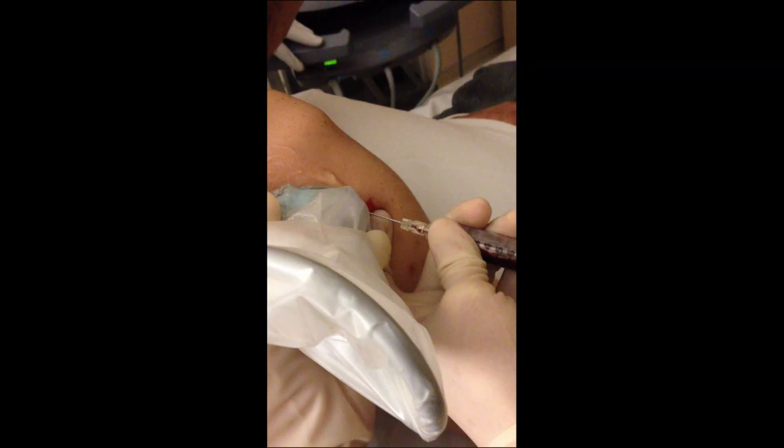What I like to do is set up with the machine in direct line of sight, so that when I'm looking down at the patient and placing my needle, I can look straight up and see the machine. It's hard sometimes because we don't like to have patients sitting up when we're putting a needle into them. So you'll have to make that judgment — if they're at risk for passing out, you can have them lay on the side that is not dislocated so the dislocated shoulder is in the air, and then approach it from that angle.